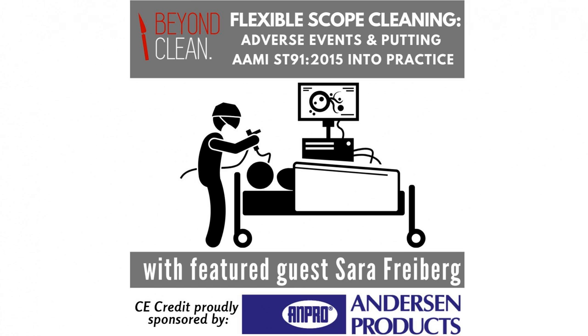Another issue that we see is not fully submerging the scope. For example, if we have a colonoscope, ideally, and depending upon your facility's sink dimensions, 10 gallons of water will fully submerge all parts and components. Most scope manufacturer IFUs recommend a sink size of 40 centimeters by 40 centimeters, which is equivalent to 16 by 16. So oftentimes users will focus only on the bending section and the distal tip of the scope, looking for that leak.